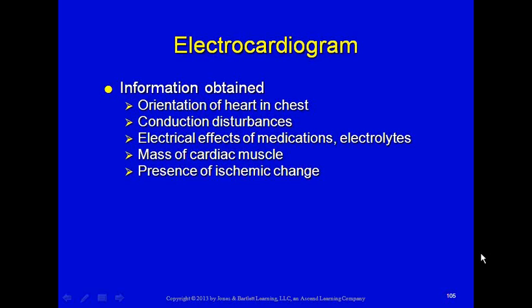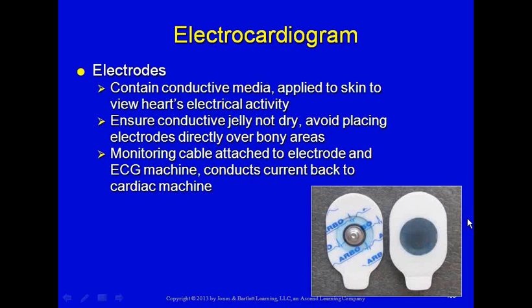We can look at a heart monitor to determine the mass of the cardiac muscle, or how large the muscle is, or how strong the muscle is, or how much electricity is going through the muscle, and we'll see those when we get to identifying things like left ventricular hypertrophy. And then we can, again, look at that heart monitor and determine whether or not our patient has inverted T waves or depressed ST segments that would indicate the presence of ischemia.